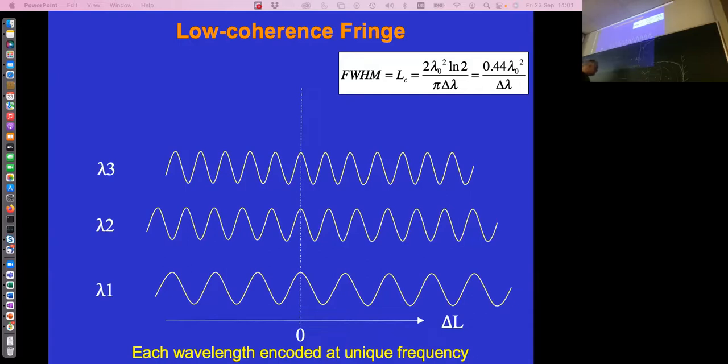And then the last term. So the total, what I get here is A1 squared plus A2 squared plus 2 A1 A2 cosine of omega 1 minus omega 2 times t. You see here that this is an interference term. So I have two different wavelengths, and I interfere them with one another. What I see is a constant term, which is just wavelength 1 with itself, plus wavelength 2 with itself, plus this oscillating term.